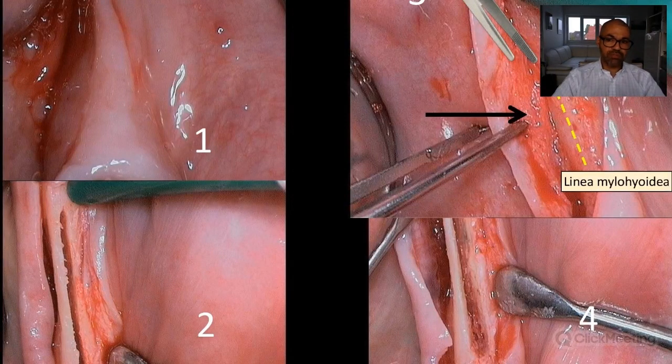Another trick is a lingual flap release. You see on slide number 3, this is a lower jaw on the left side, excuse me. You have a mid-crest incision, and once you deflect it a little bit, the lingual area, you will see that there are muscles inserting from the musculus mylohyoideus.